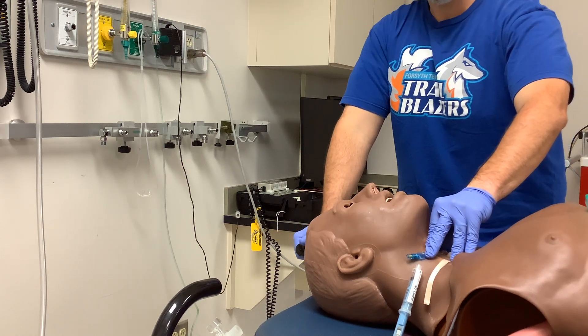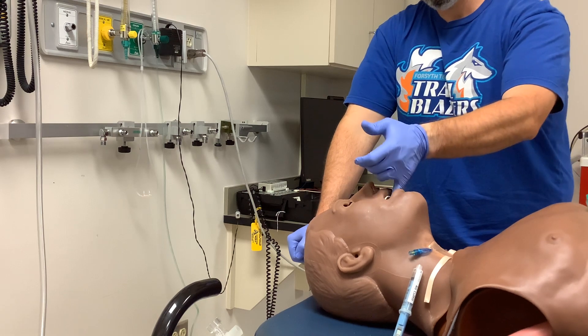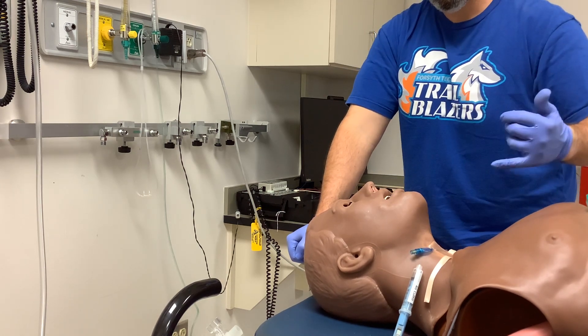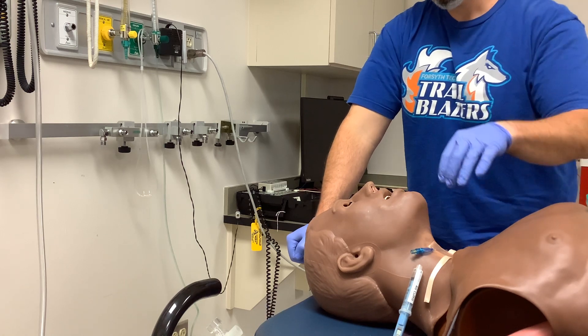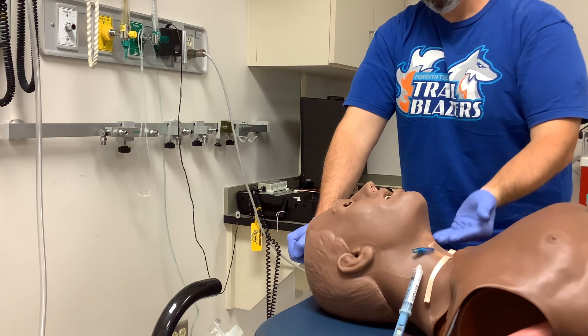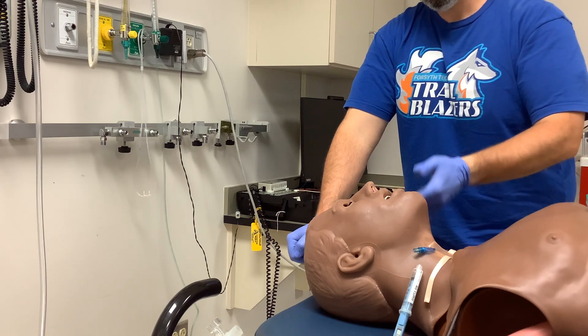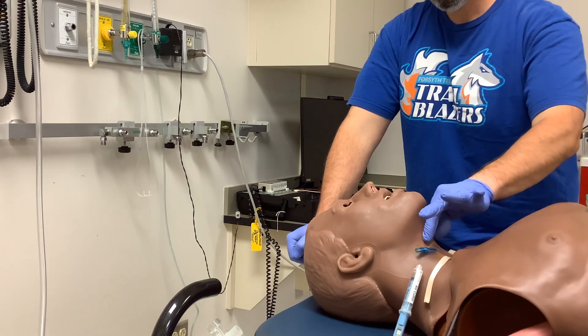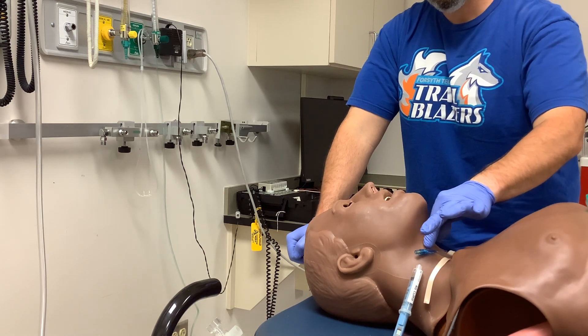It has evolved to be utilized during intubation — you have someone performing a laryngoscopy and they say 'give me some cricoid pressure.' What they want to do is take the more anterior airway and move it posteriorly so that it comes into their plane of view while performing laryngoscopy, with the laryngoscope in the mouth visualizing the cords. They're hoping to drop that more anterior airway down into view.